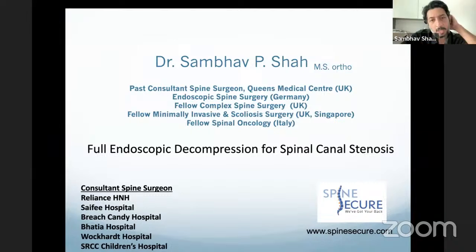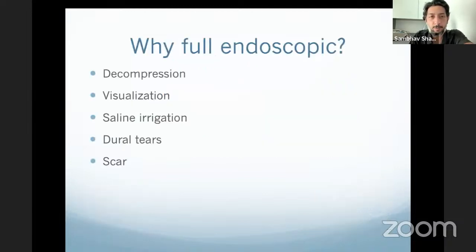So I'm going to be talking about full endoscopic decompression in the case of spinal canal stenosis. So we've seen Dr. Lokhande's technique already, and this is just something which I'm doing before doing a fusion. So probably once you do a couple of these decompressions and they're safe in your hands and you've mastered the technique over here, then probably we can go and start doing fusions.